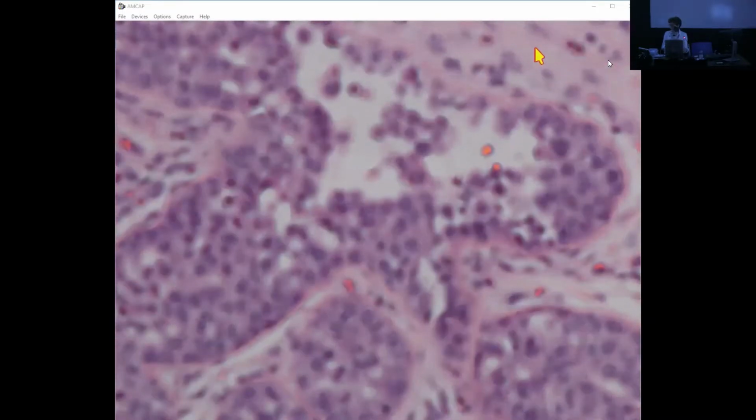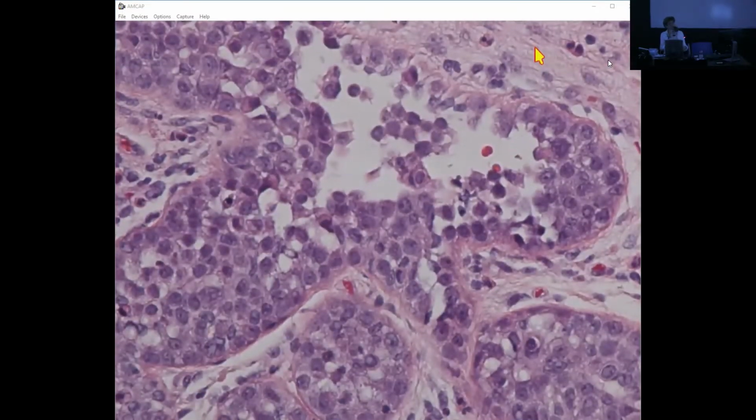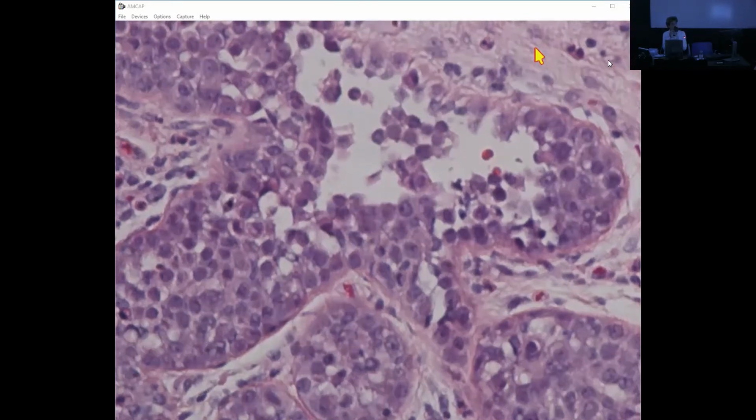The comment was only because of the border between type B and pleomorphic. Yeah, it's useful in those cases. I think it has some utility, and it's good to recognize these two variants, and especially not to call these, in comparison with the type A cells, florid, or think that this is more pleomorphic. These are normal cells in classic lobular neoplasia.